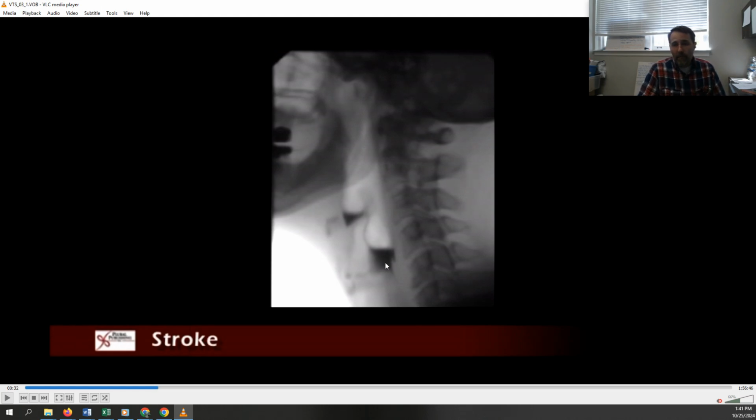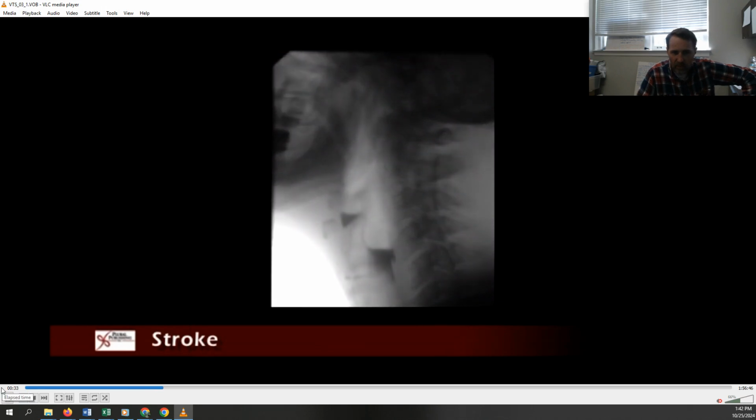We had pooling before the pharyngeal swallow, and if the pharyngeal swallow is happening, which something seems to be happening because he's getting bits and pieces down into the esophagus, then we would then call this stasis, and that's just a lot of residue because as you can see, there's just not much happening pharyngally. And on top of that, you have the barium piling up in the piriforms until it is spilling into the airway and coursing down the posterior pharyngeal wall.